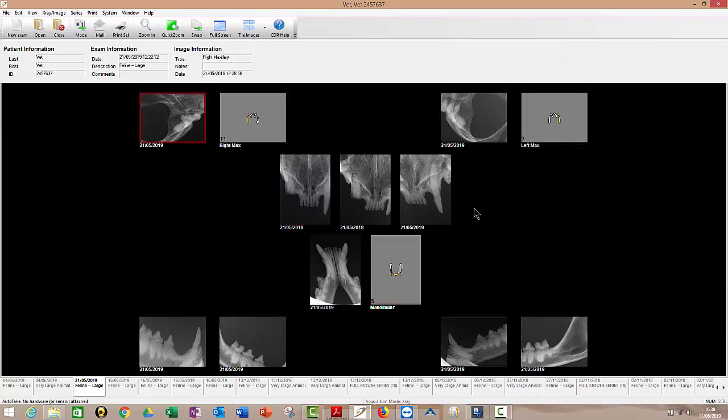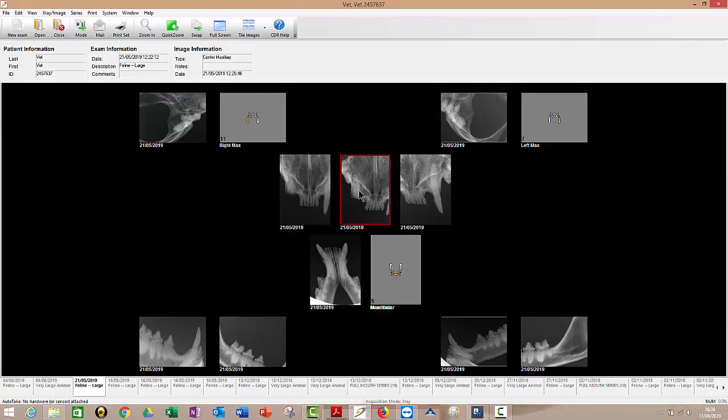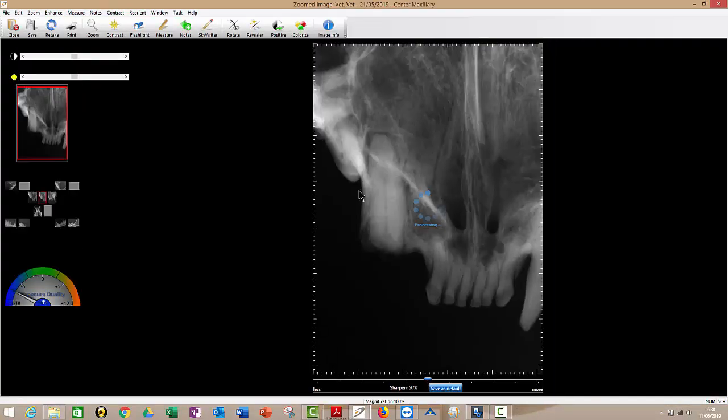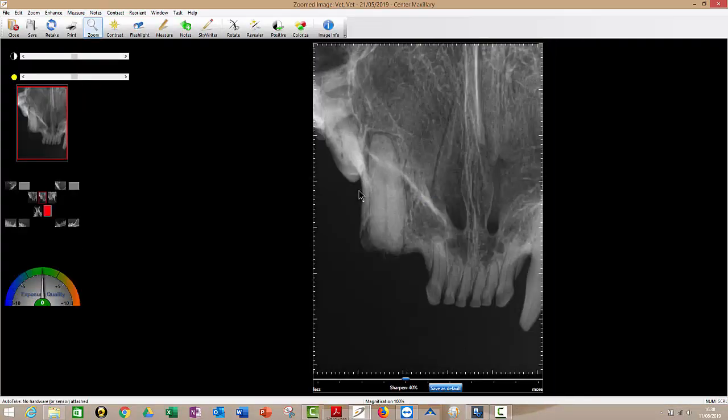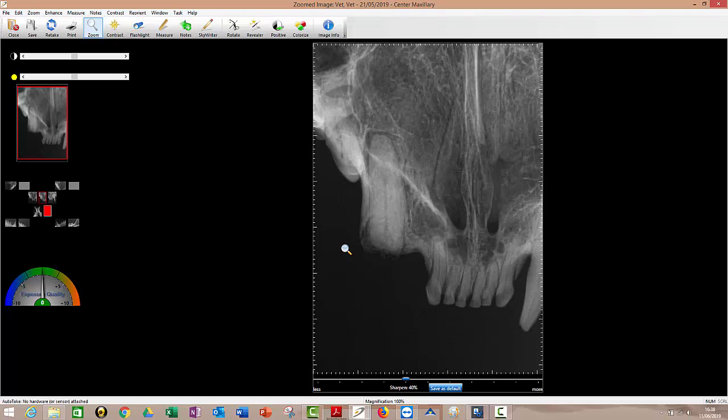So just say you've taken all these images. Now you want to review them. So the way you do that is you just open up the image that you're interested in by double clicking on it. When you actually fire your x-ray source at your sensor, it will actually arrive on screen like this about two or three seconds after you've fired your trigger. So nice and quick.